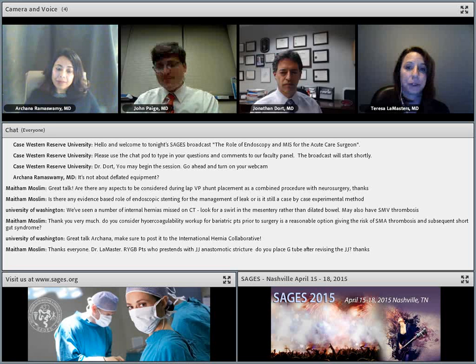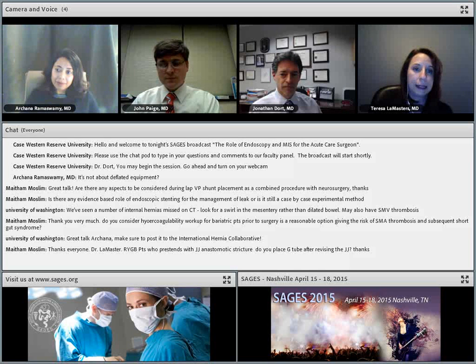It's not adhesive disease. Occasionally there are, but those are more likely, I think, to be successful laparoscopically than the general adhesive small bowel obstruction. Having said that, I'm very much an advocate of exactly what you guys said. Put a camera in, and you at least know where you're going and can limit the invasiveness.